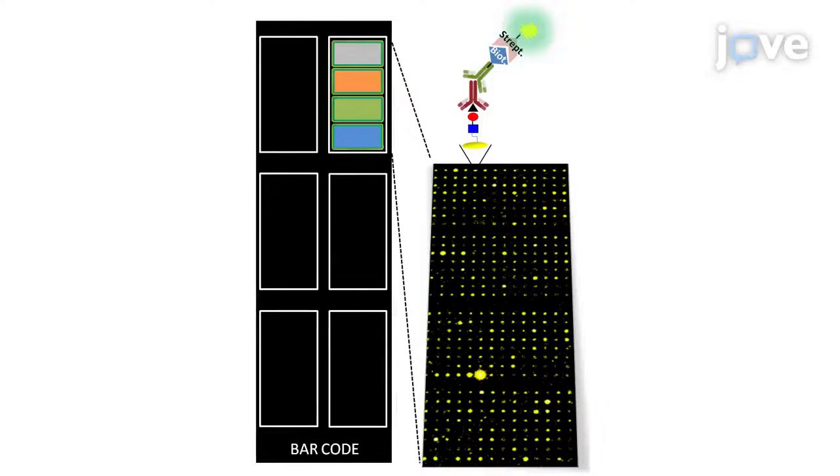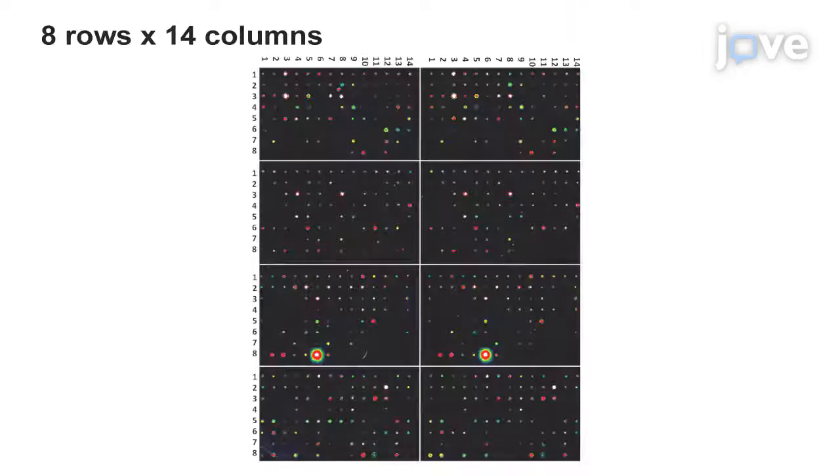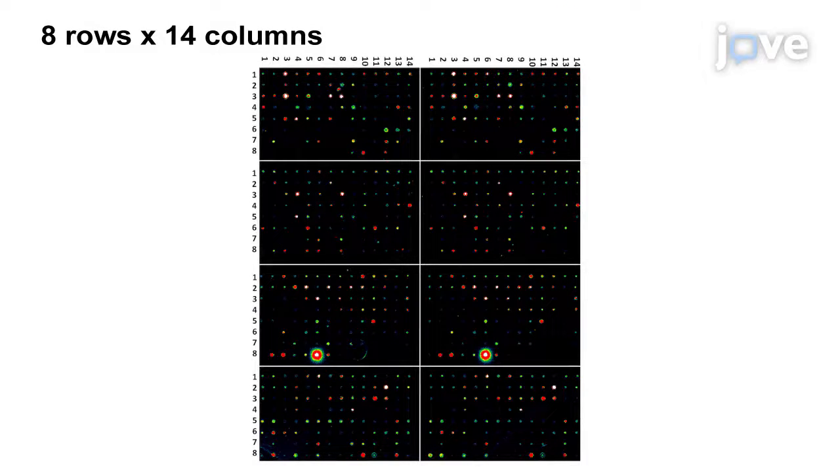Each slide contains four different blocks of subarrays, repeated six times. Every single subarray is formed by 112 different glycan spots, including controls.